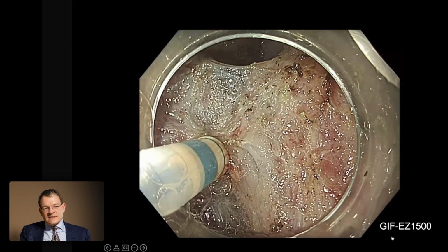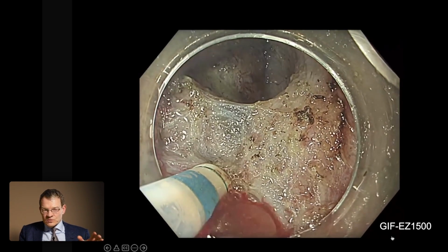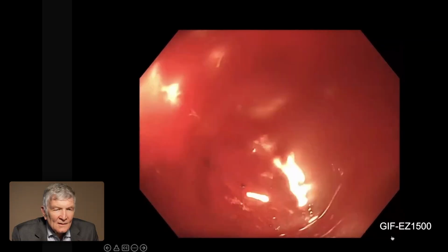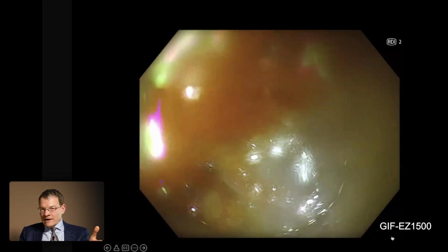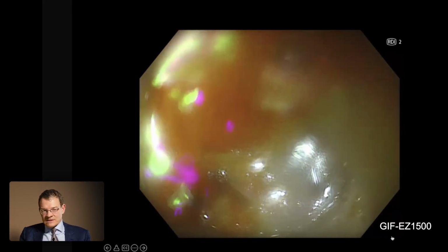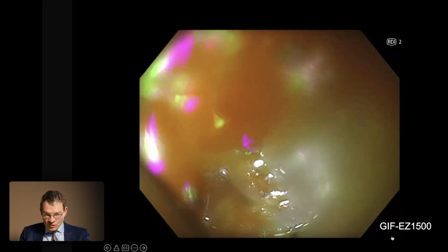So I've chosen now really some severe bleedings. So this is here an ESD, and incidentally a vessel is cut, and this is a typical situation that you lose the overview. Everything turns red. And you see there's something ongoing in the middle, but not... Exactly, but now using RDI you have less blood and you definitely can better see the source of the bleeding. So in such a situation this is very helpful for sure.